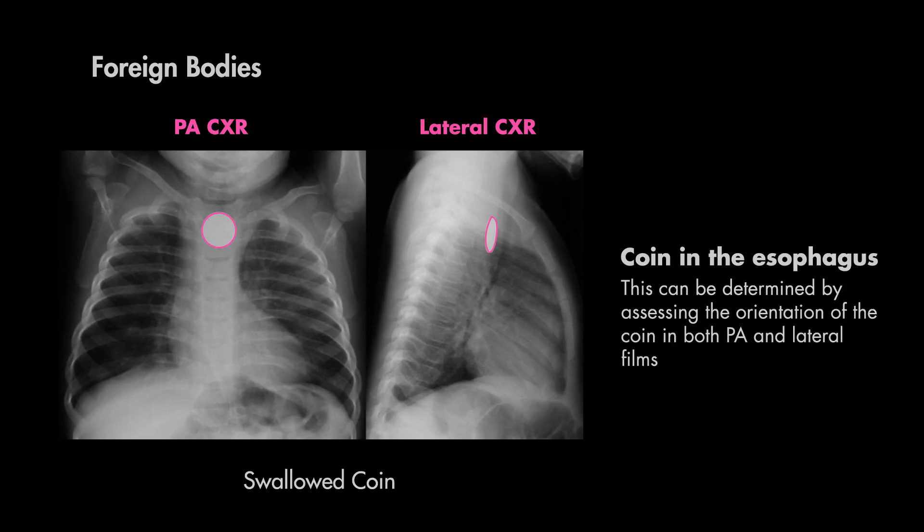If you didn't have the lateral film and only the PA film, you might have assumed that the circular object was perfectly round.